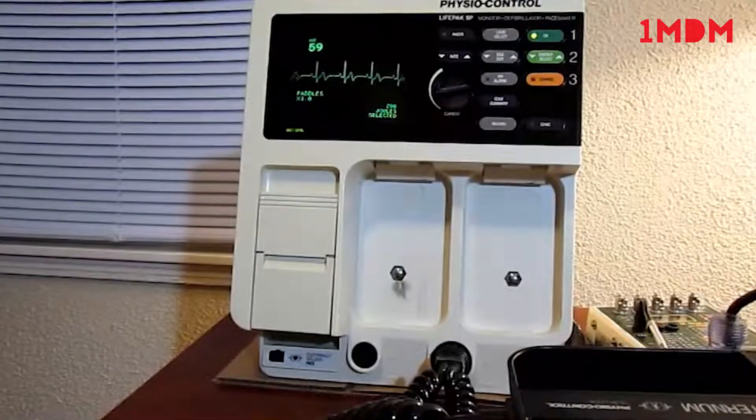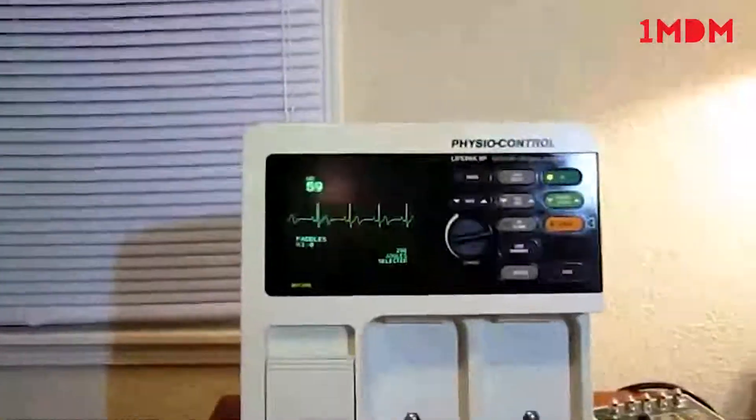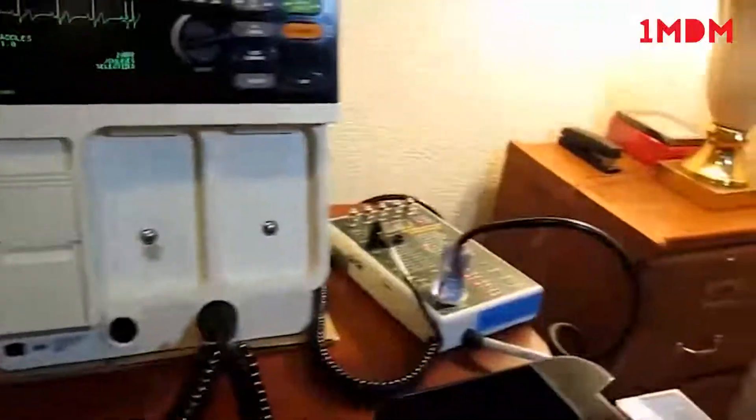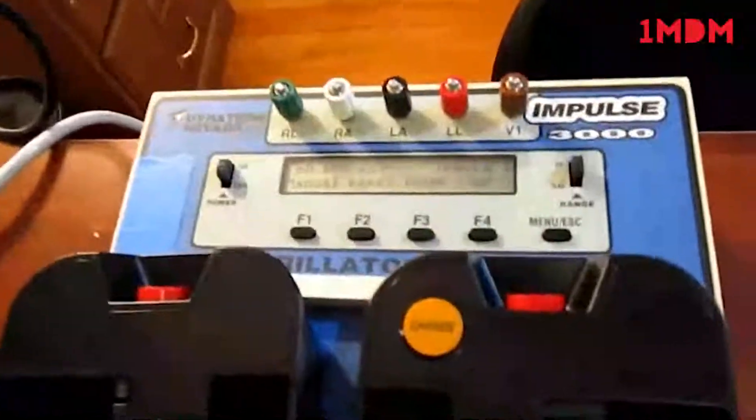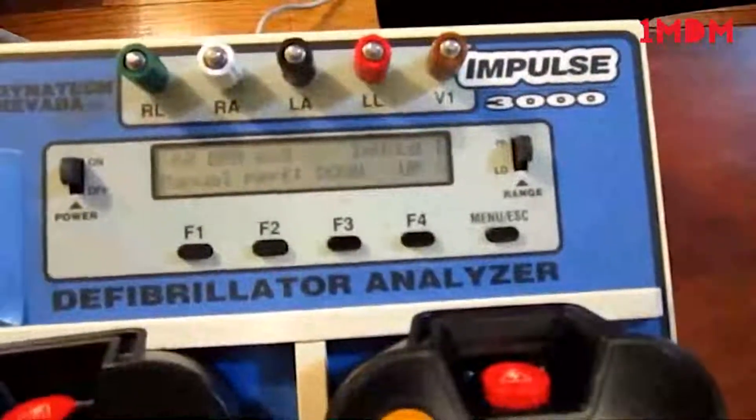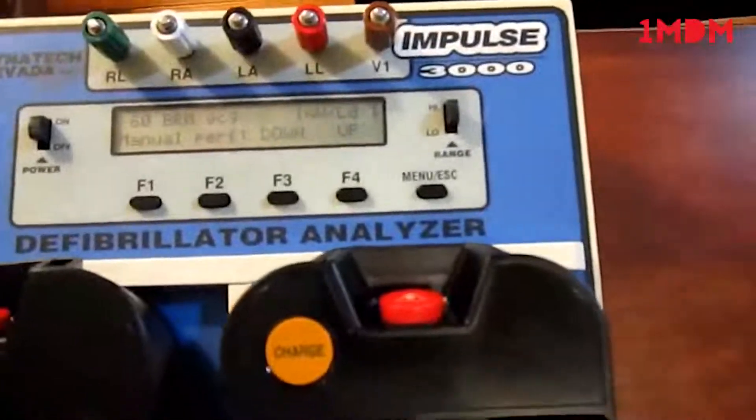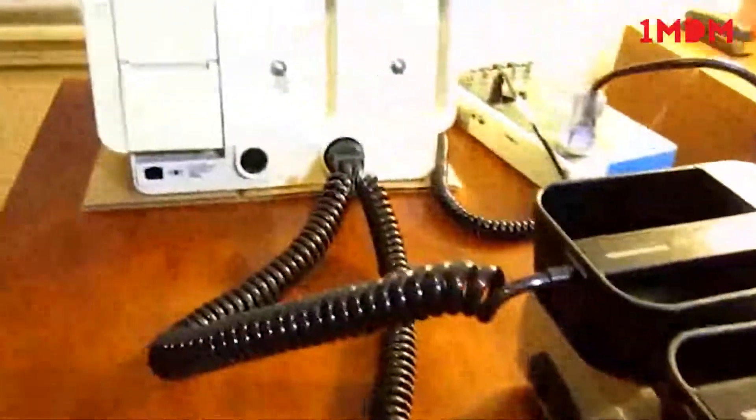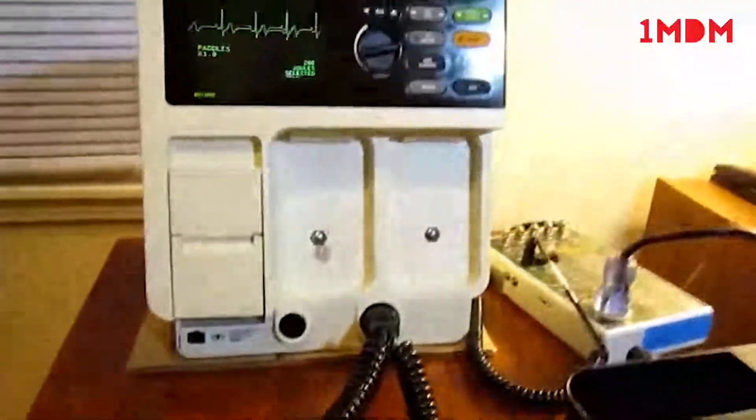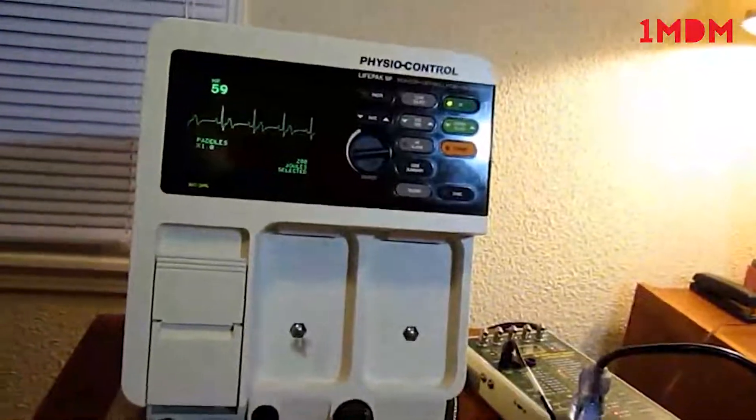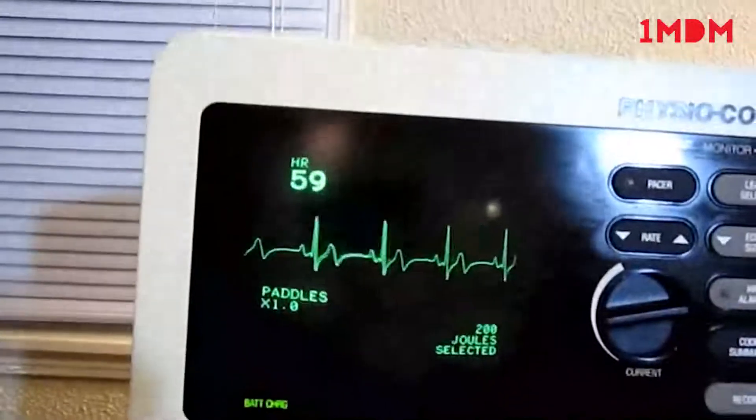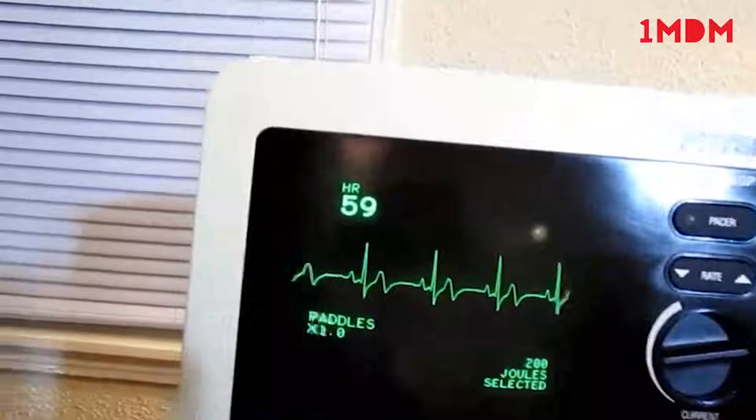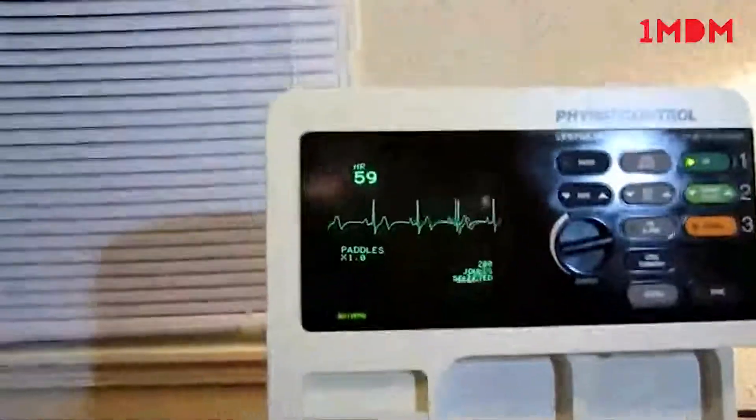So now we're checking the monitor. We're feeding 60 beats per minute from our tester simulator. We're actually using the pads as the pickup since this unit doesn't come with an EKG cable. The monitor is reading 59 to 60 beats per minute, which is what we're feeding it.